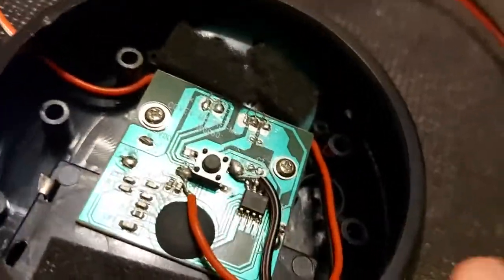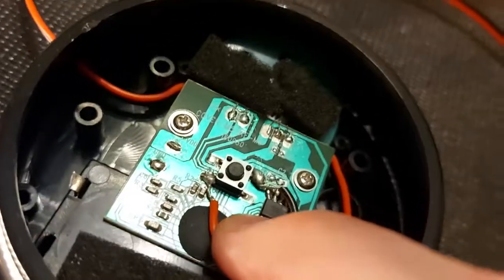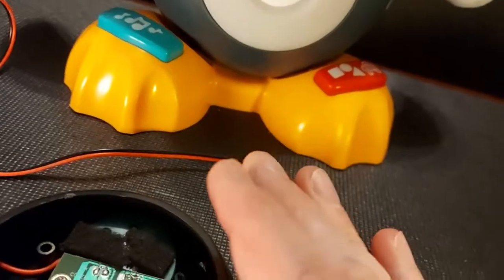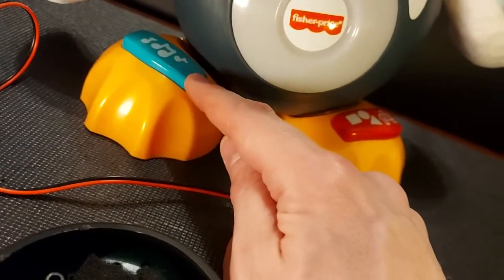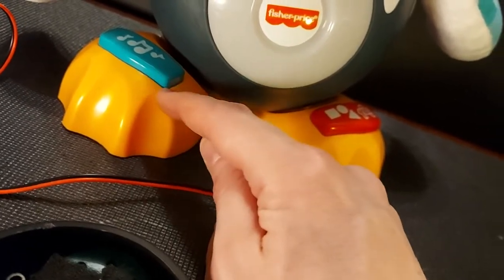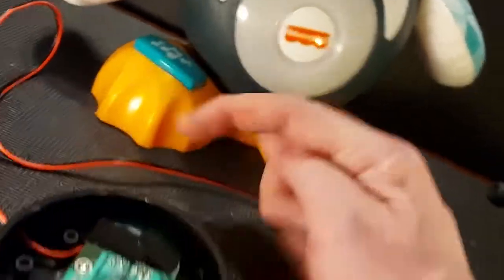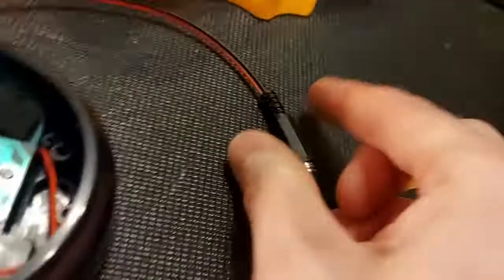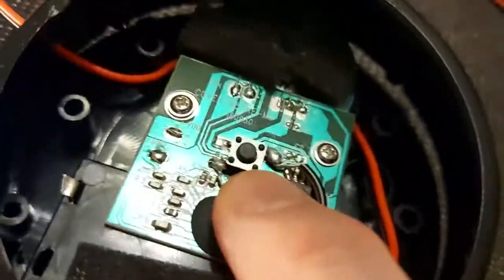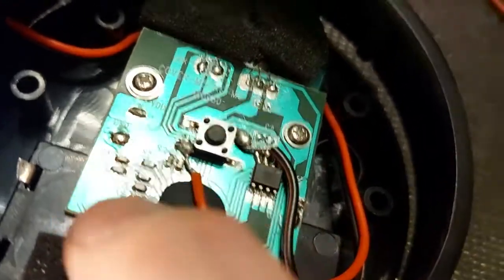I'm trying to reduce anything that could short. A short isn't really dangerous with this especially since there are no batteries in it, but what it might do is cause the toy to continuously run because it would be as though the switch is closed. What we're doing is shorting the port — I've soldered to the two sides of the switch that run this button and then sent it out the back of the machine through the switch port. All it's doing now is connecting right into this switch.